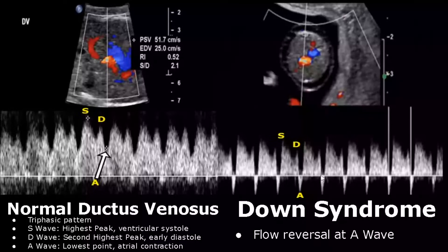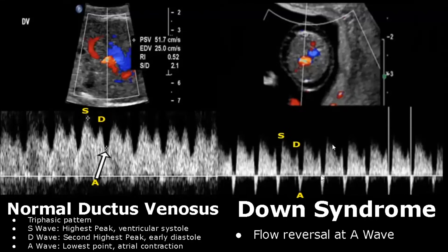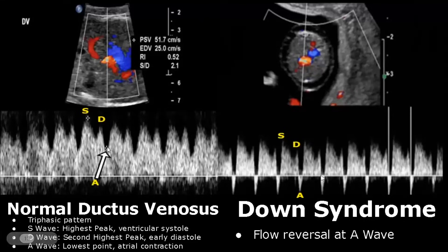A fetus with Down syndrome can have an abnormal spectral Doppler waveform of the ductus venosus. Here is a normal spectral Doppler waveform of the ductus venosus — it has a triphasic pattern. The wave with the highest peak is the S wave, occurring at ventricular systole. The D wave is the second highest peak, representing early diastole. The lowest point is the A wave, representing atrial contraction. In an abnormal waveform, we will find flow reversal at the A wave — the A wave is seen below the baseline.